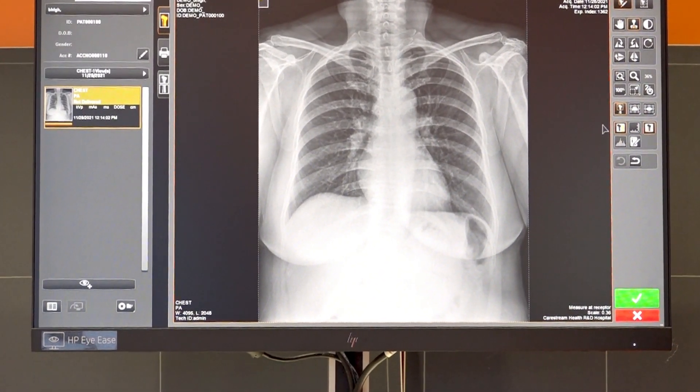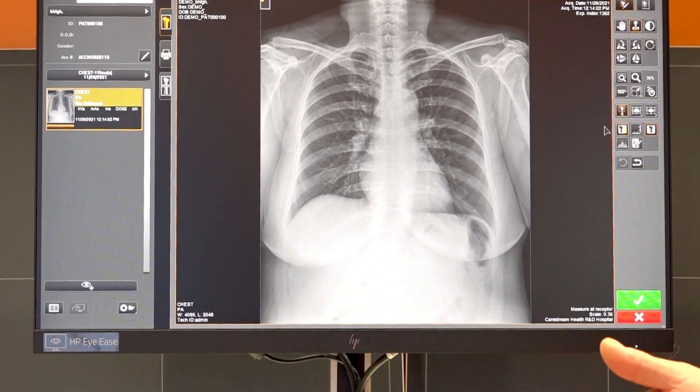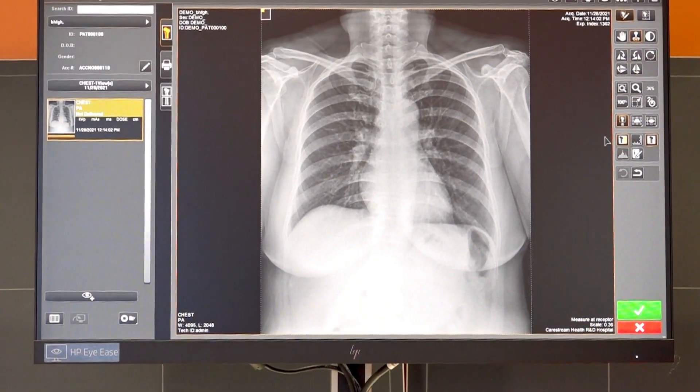In addition, the mini PACS functionality allows acquiring images from other modalities such as CR, DR room, CT, MRI, and ultrasound, and sharing them among all the web client network.